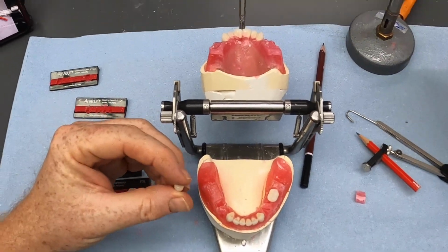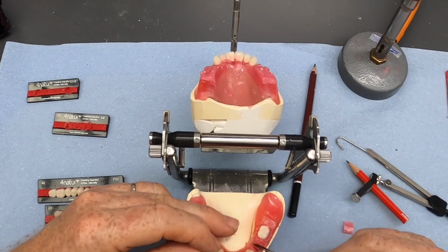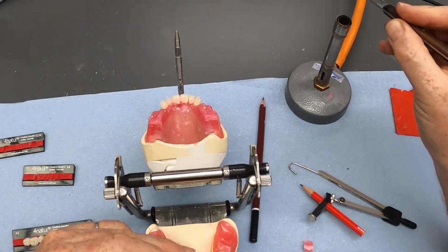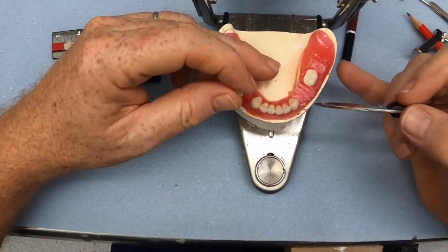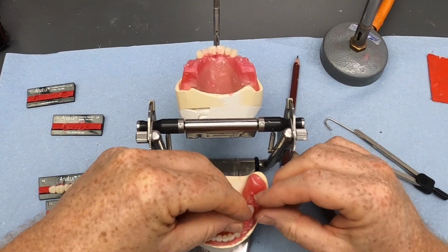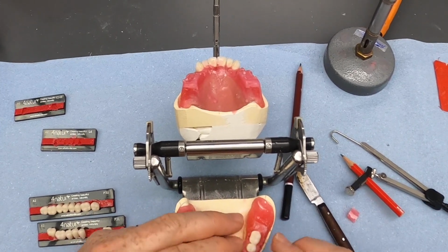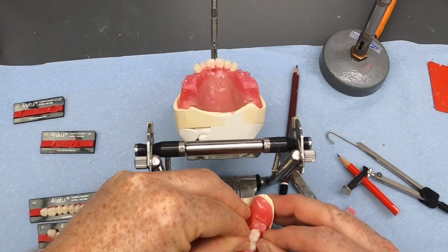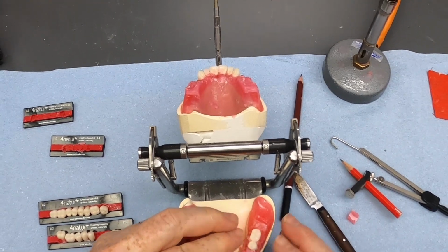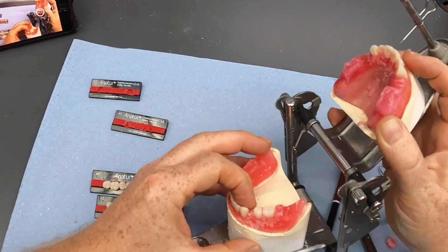So let's take the 5 and soften the wax in between the 3 and the 6 here. Try and get both set. Again, we can position this tooth in line over the alveolar ridge. Make sure it's butted up nicely to the 6, like so. Have a look from the side, a little bit low, bring that in.